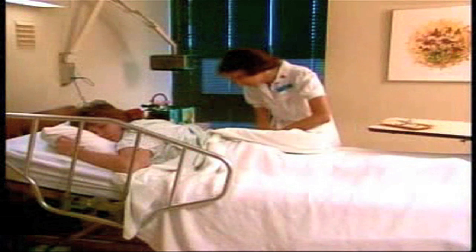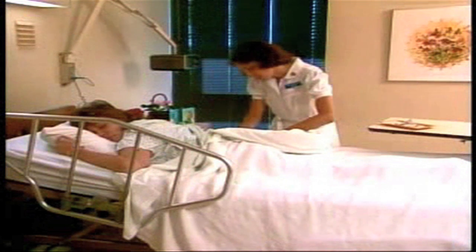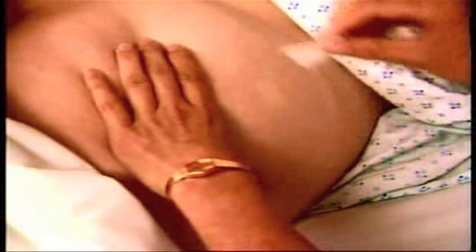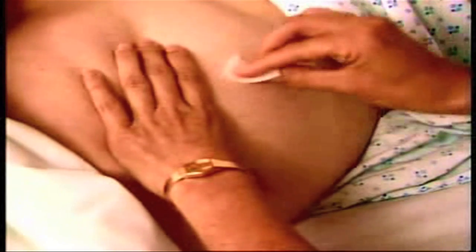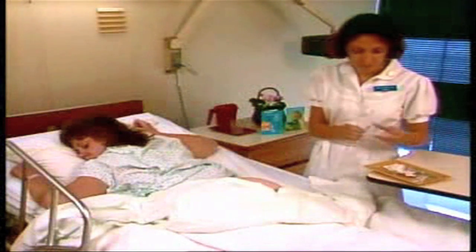Select the best site for the injection. Site rotation is necessary for patients requiring frequent injections. Then clean the skin with an alcohol wipe to remove any surface contaminants. Use a circular motion beginning at the center and move out toward the periphery. Remove the needle guard, being careful not to contaminate the needle.